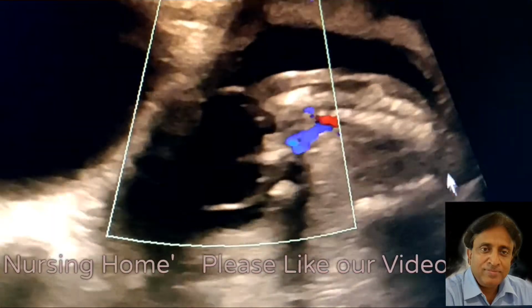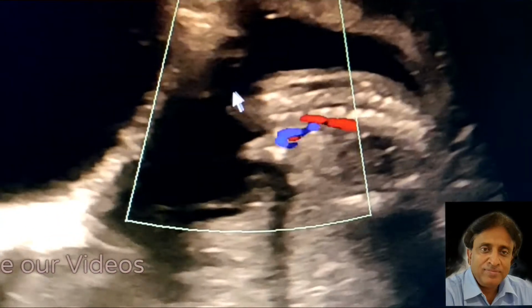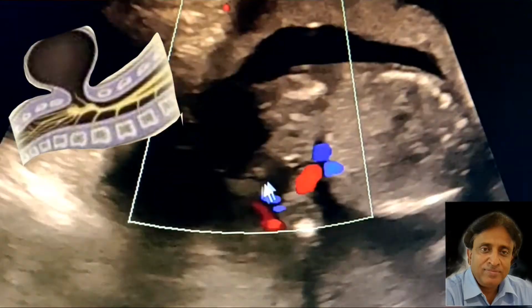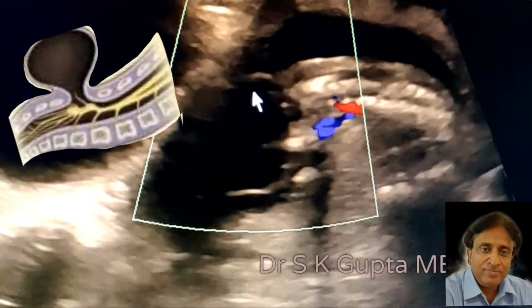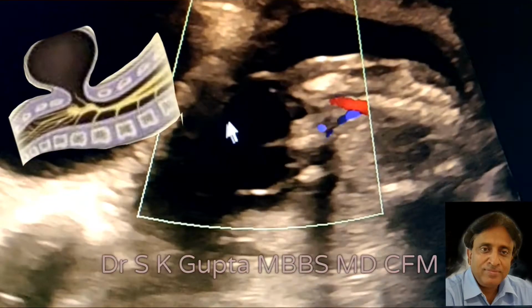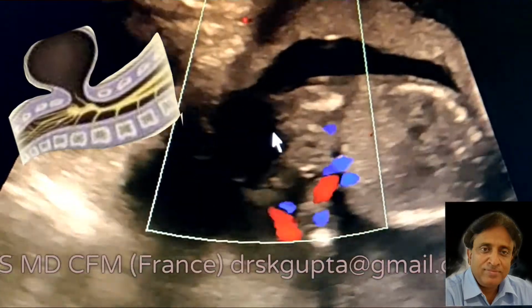Trying to see it in the longitudinal view, this is the longitudinal view of the spine, and here you see that there is a hypoechogenicity, and this hypoechogenicity is nothing but the meningocoel of the sacrococcygeal region. There is a spina bifida defect in the sacrococcygeal region.